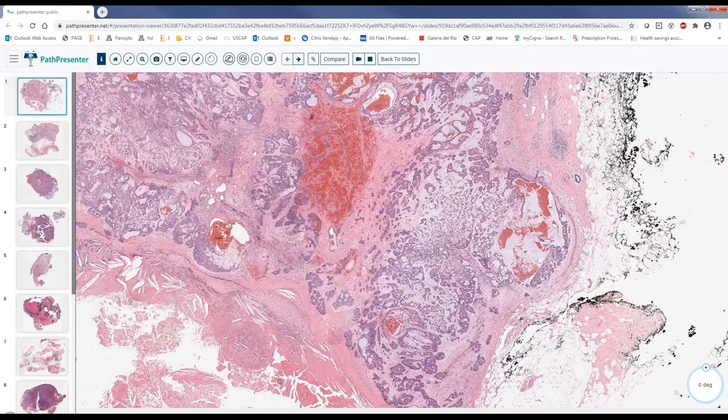The size, again, we put the size in the report, so it is more than 2 cm. And if it is affecting not only the superficial lobe but basically the deep lobe, and there are sudden changes, patients with these risks will probably be having carcinoma changes, so transformation or malignant transformation. Okay. The good news is that radiology is fantastic.